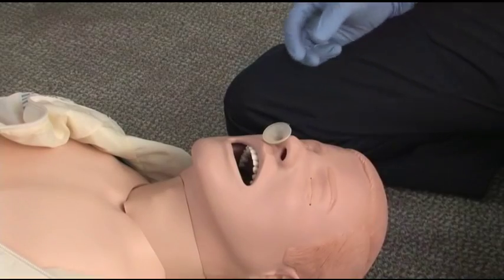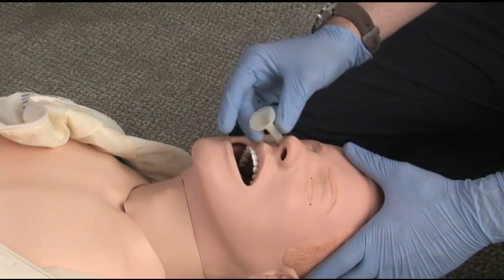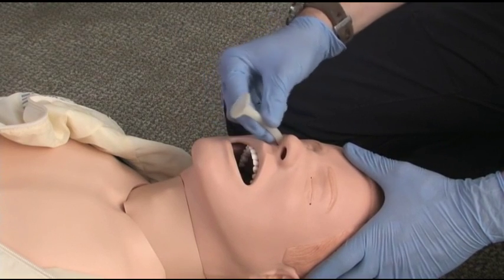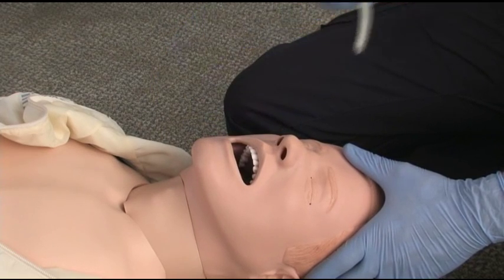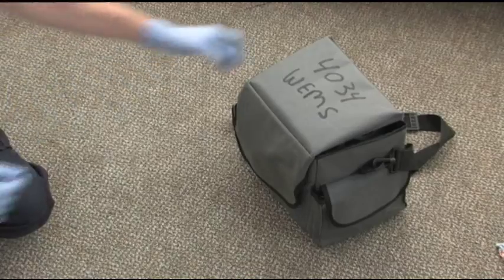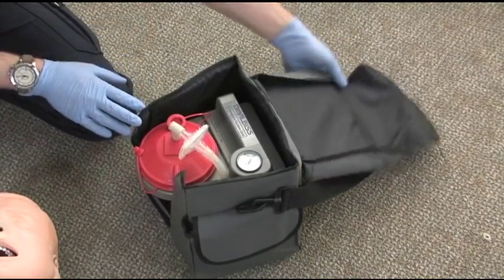If the patient's level of consciousness improves and a gag reflex returns, the airway may need to be removed. This can be accomplished by grasping the proximal end of the airway and pulling it gently out. Suction should be available during this process since patients sometimes vomit during the removal process.